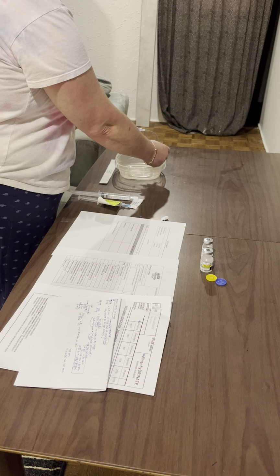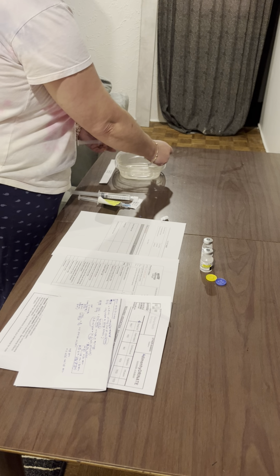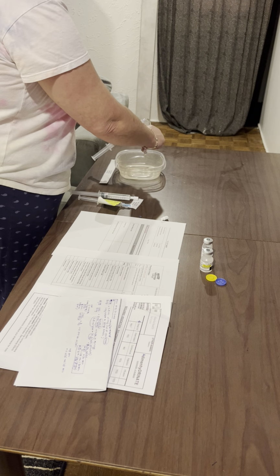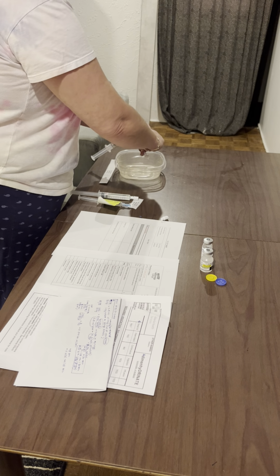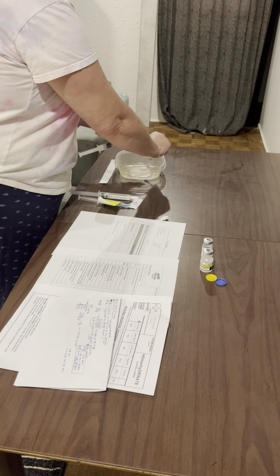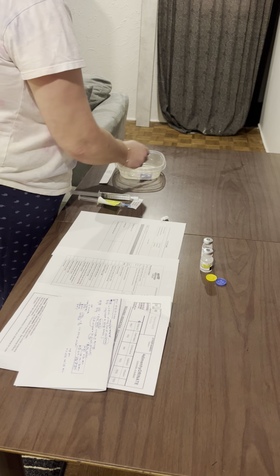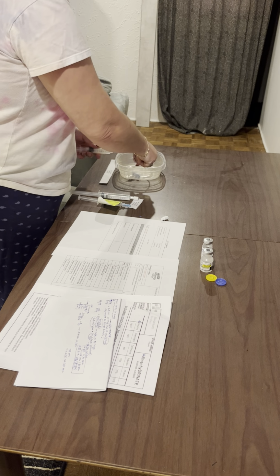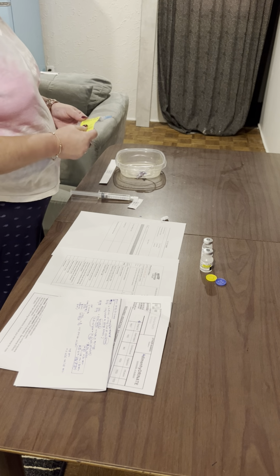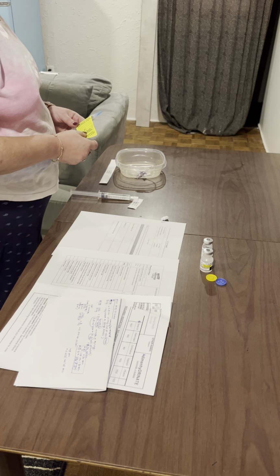So, being careful to maintain sterility, we can just saline lock this again for now. Okay, great. And we can remove the flush. So we flush for patency, and we've seen that that's okay. Okay. So the next step is to actually give the medication itself.